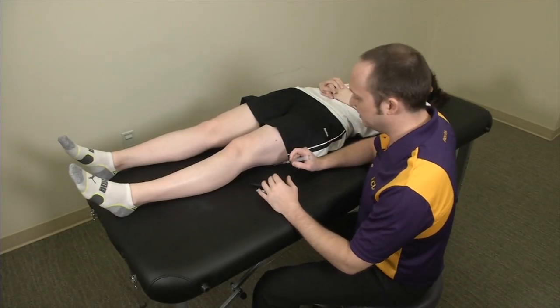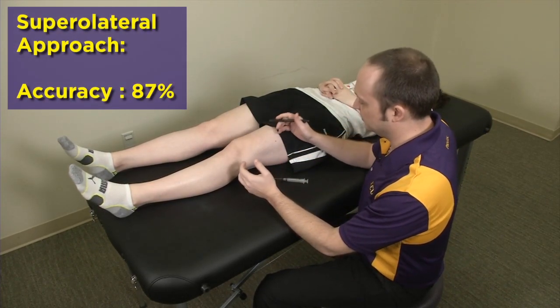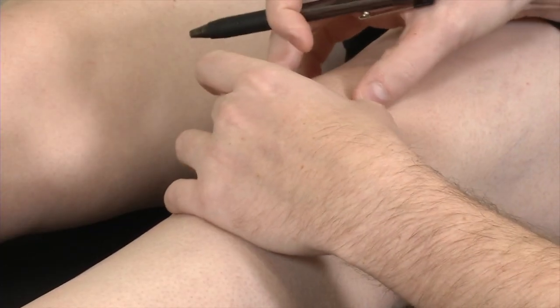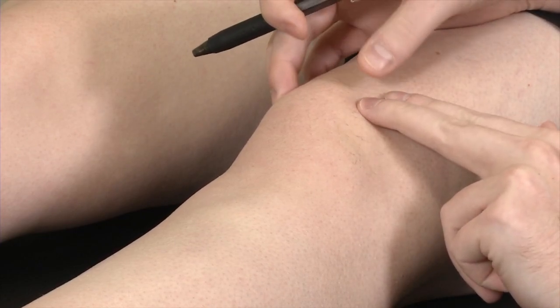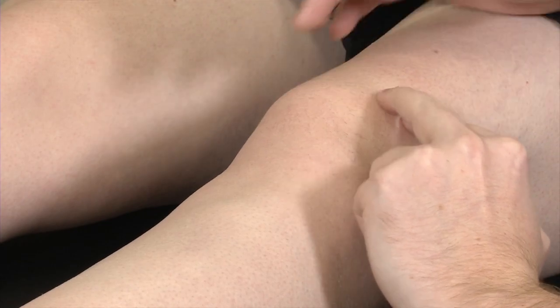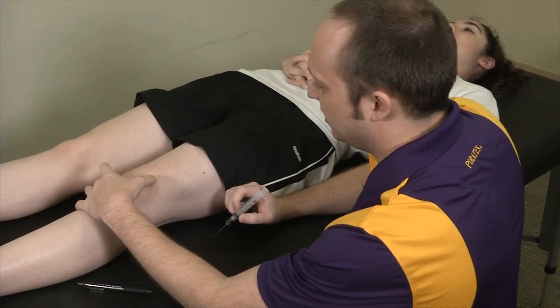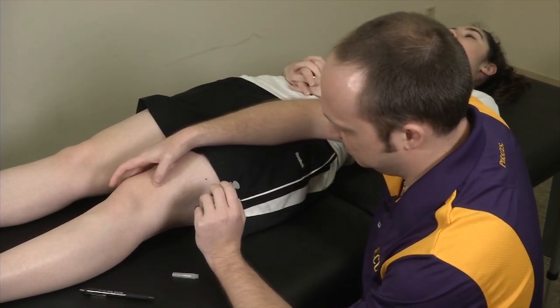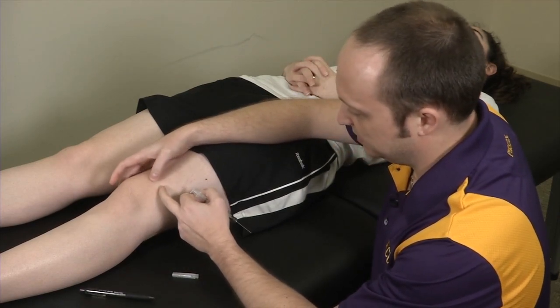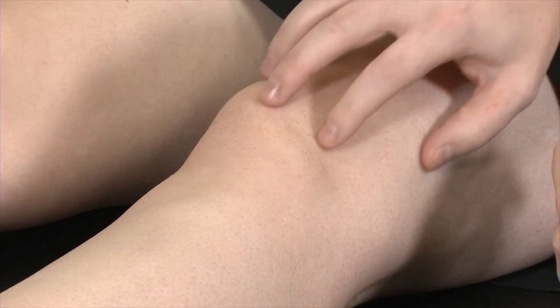Our next injection that we're going to demonstrate is the superior lateral approach into the knee. Similar to the medial retropatellar, you're first going to mark your site. If you define the margins of the patella, you find your superior lateral pole. Roughly two finger breadths superior, two finger breadths lateral is going to be your entry point, so you essentially mark that. You then go ahead and clean the skin. That's going to be where your needle is going to enter, and your angle is going to be going towards the medial femoral condyle. While this isn't my favorite approach for injections, this is probably going to be your preferred approach for knee aspirations, as they're going to have a large effusion in this area.